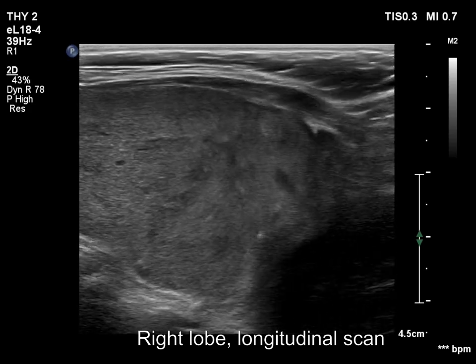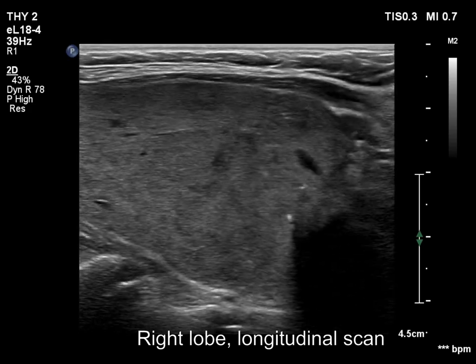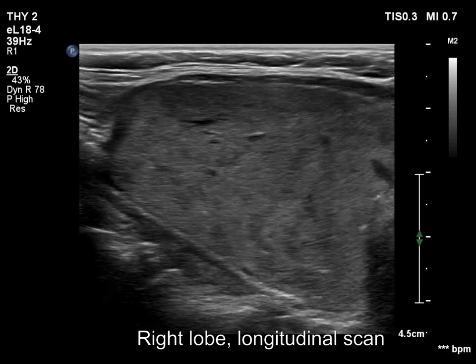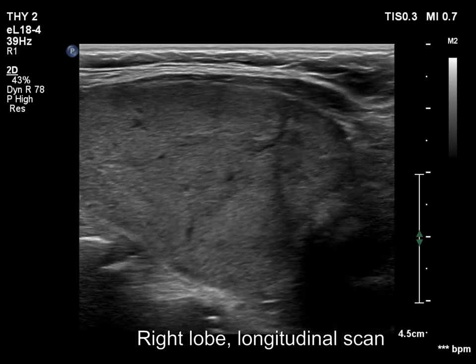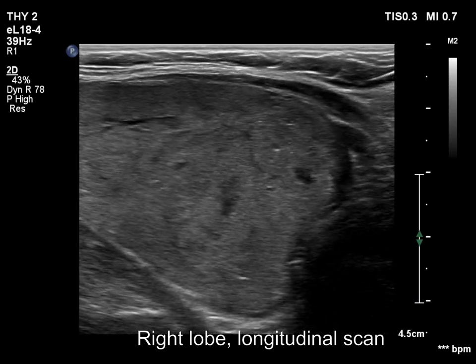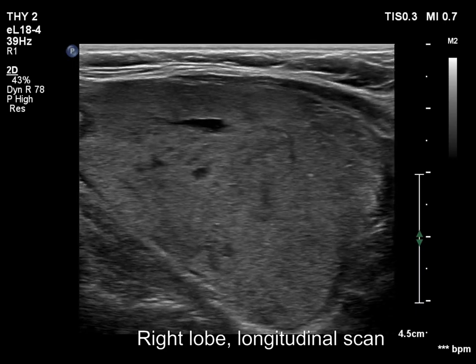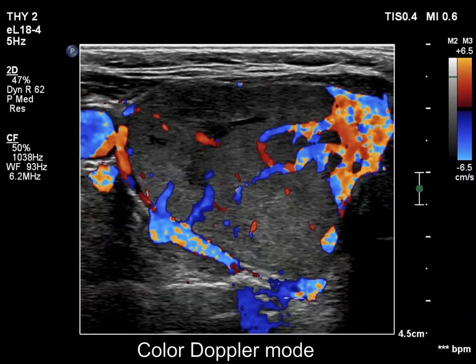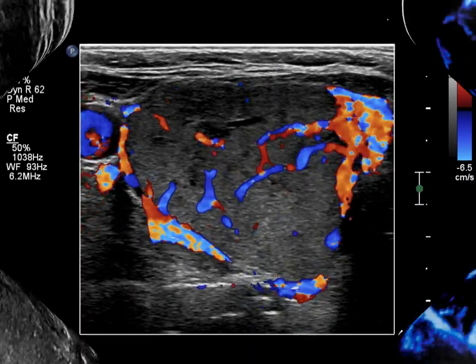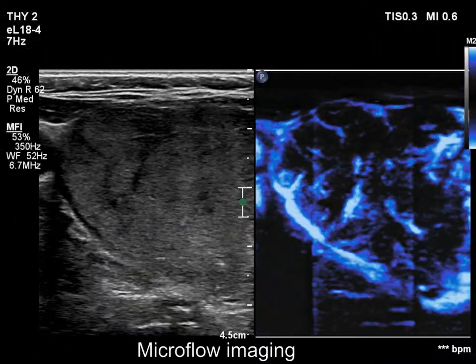The lower pole is clearly seen on longitudinal scan. The echogenic granules are probably related to cystic areas. The nodule has both perinodular and intranodular blood flow.